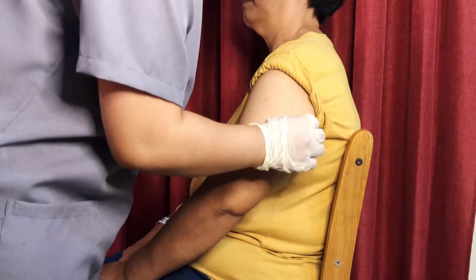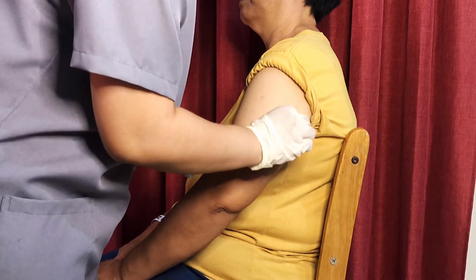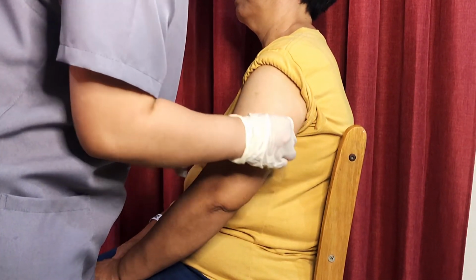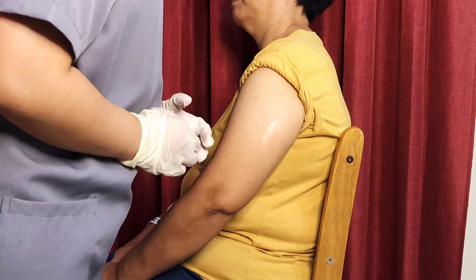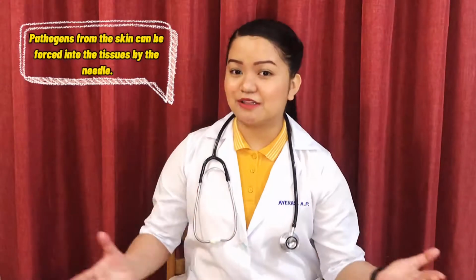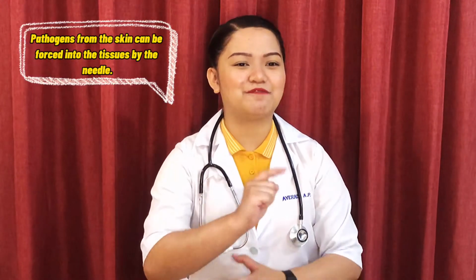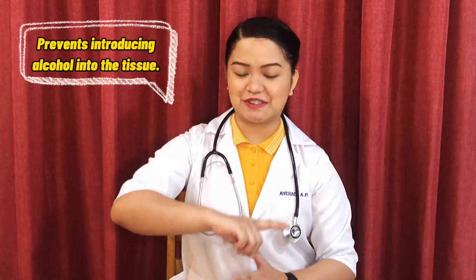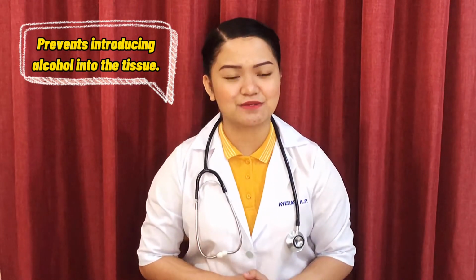And then, clean the site with an alcohol swab or antiseptic swab. Use a firm circular motion and allow the site to dry. Pathogens from the skin can be forced into the tissues by the needle. Allowing the skin to dry prevents introducing alcohol into the tissue, which can be irritating and uncomfortable.